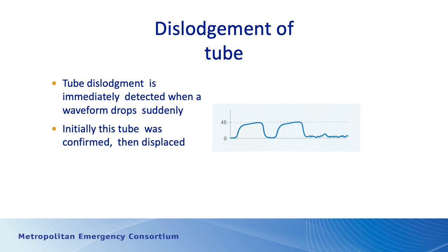So if you place an endotracheal tube or an iGel, you need to have them on ongoing capnography, and you need to pay attention to the waveforms, because if you lose waveforms, then you go back to square one and you reaffirm the tube's correctly placed, the patient's being ventilated well, and so on. I mean, you also have to check for mechanical problems like disconnection of the lead to your monitor, but we have to keep that in place, and it is a standard of care.